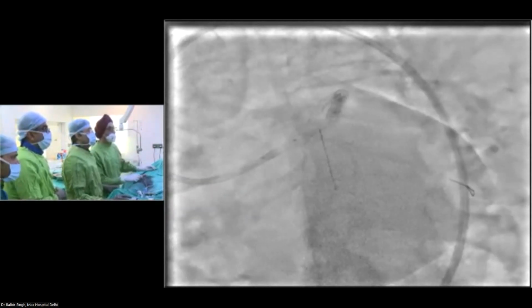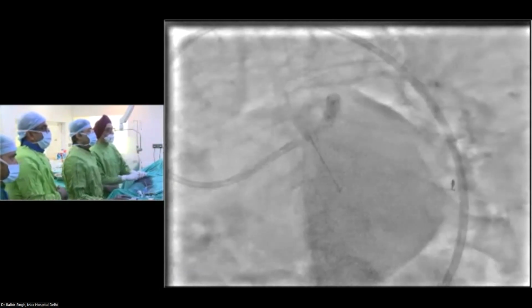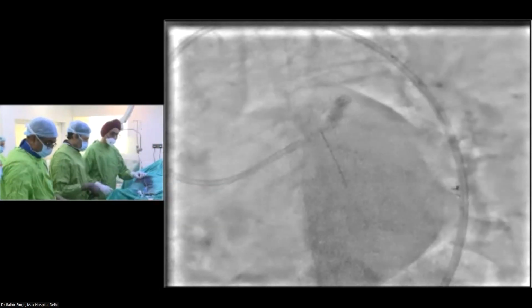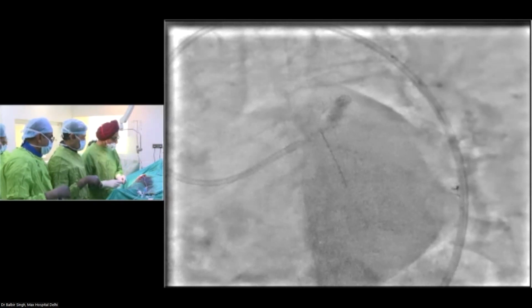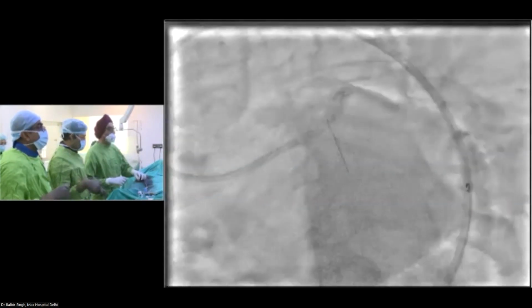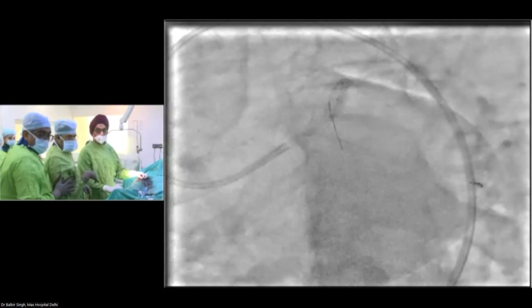So you were right. It's going to give me a lot of trouble. Please take a 1.0 low profile balloon. Don't push too much. When we are doing these maneuvers, I think we have to also take care of the LM stent because there is a possibility of distortion, deformity. The other option would be to take a microcatheter, which is like a 1.5 balloon, to screw that in there, and that'll give you a little extra. That's like doing a 1.5 balloon.